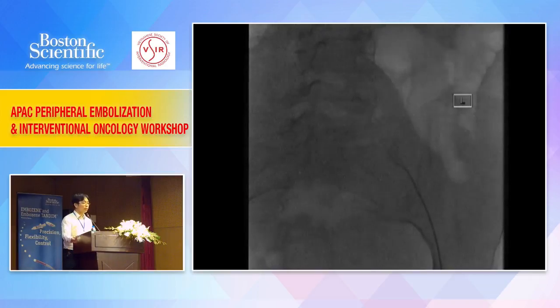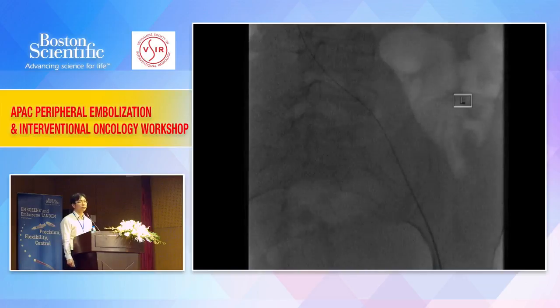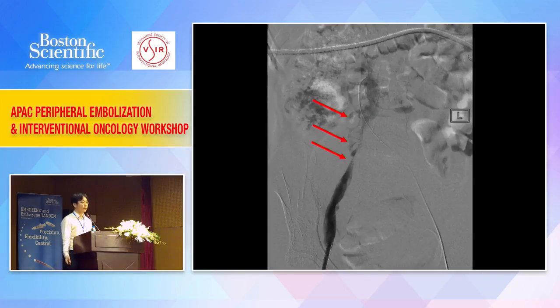So if you're in the wrong place, you just need to find the right place. And I can tell you this is extremely, extremely simple for us who muck around with microcatheters. You're dealing with an 035 system. It's extremely simple. You don't get where you want to go initially, just bring your catheter back and then find another lumen. Even if you perforate, so what, big deal, this is really occluded. It's not going to bleed. You don't care. I don't care.